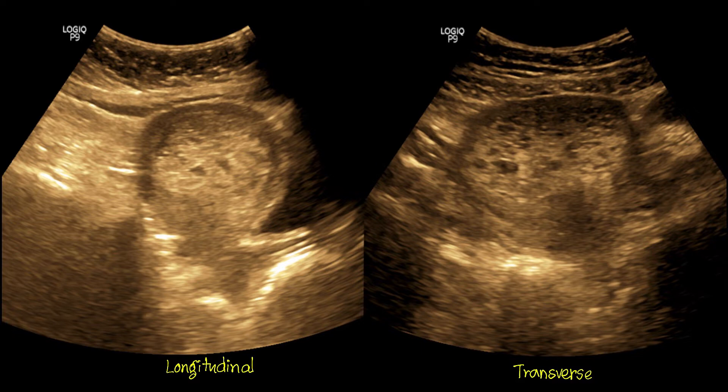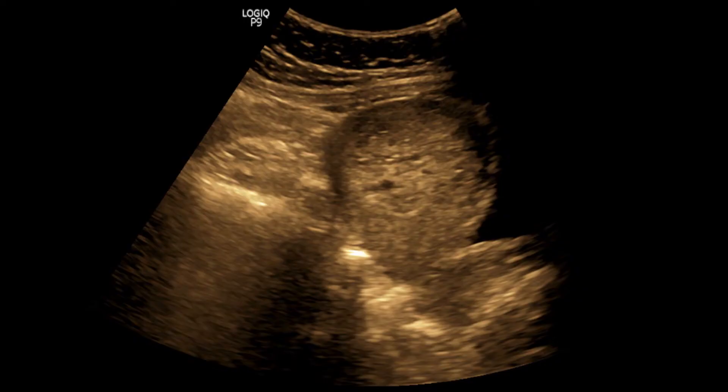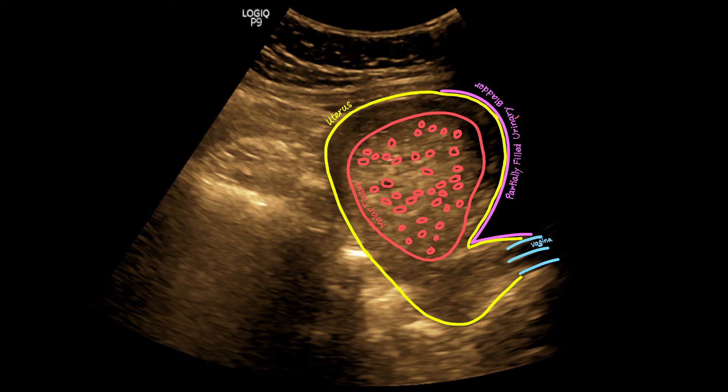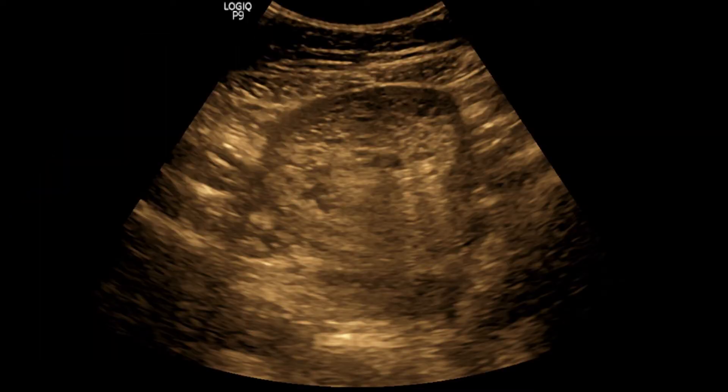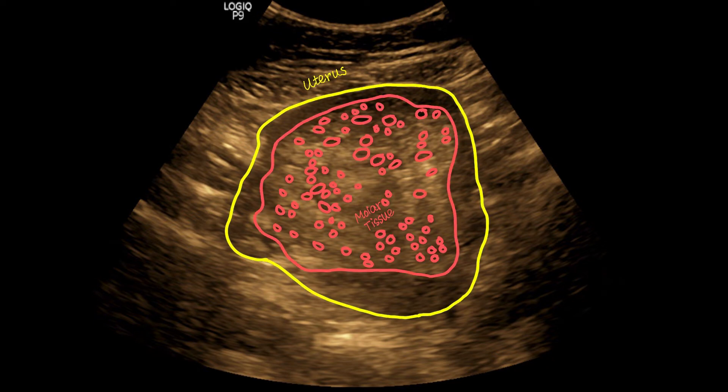Let's check separately. This is the longitudinal section — note the echogenic central uterine mass with internal diffuse cystic areas. On transverse section, the image quality may not look good due to lack of urinary bladder preparation.